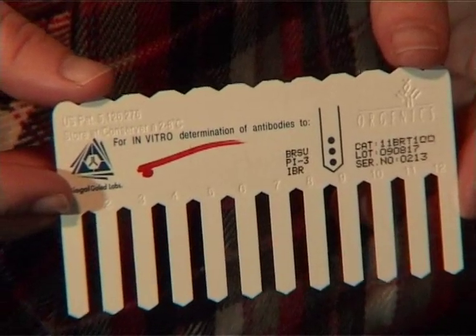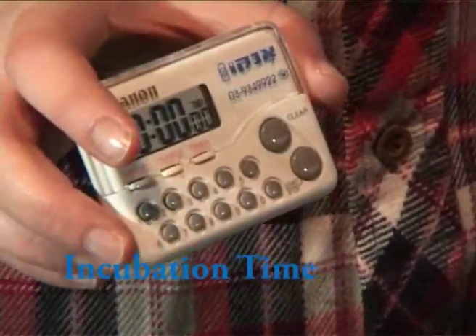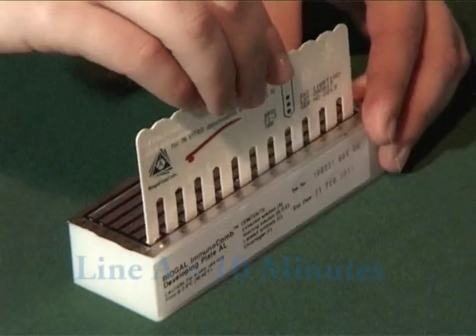Insert the comb in line A and develop for the time stated in the instructions. During the process, gently move the comb up and down.